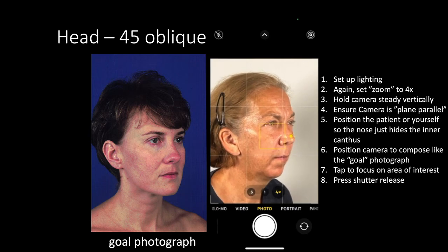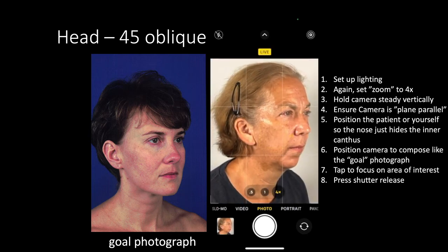Tap the screen on the area of interest to focus the camera, then press the shutter release.